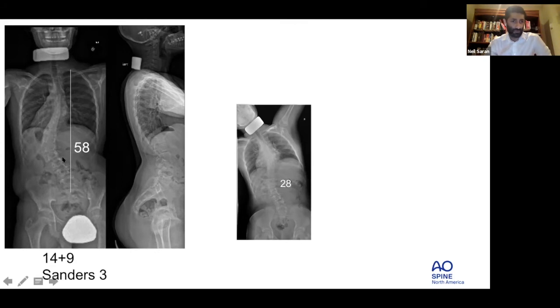End vertebra to end vertebra. So it's L3. Again, do I go to L4 on this? He's so deep set, there's no way I'm going to get an L4 on this one.